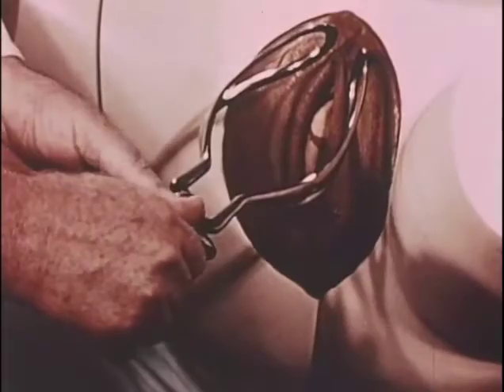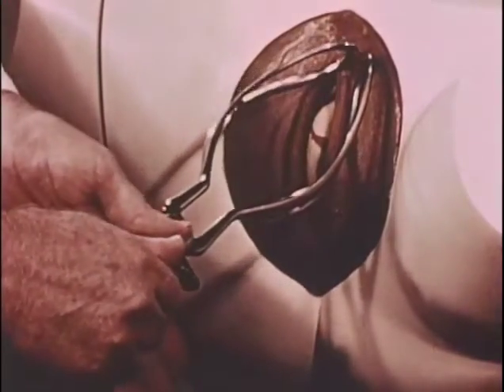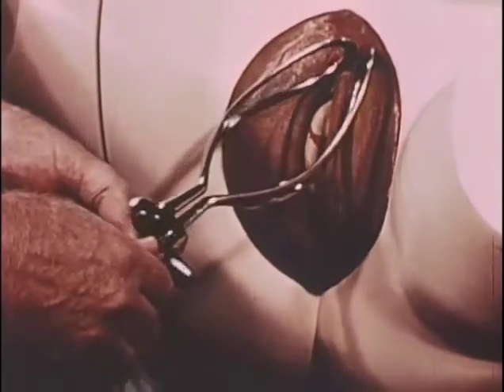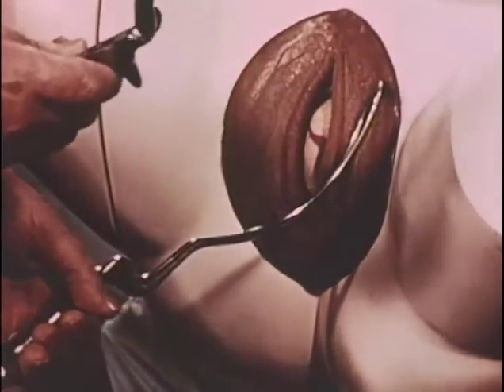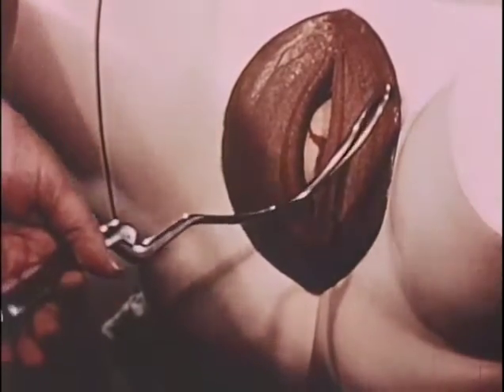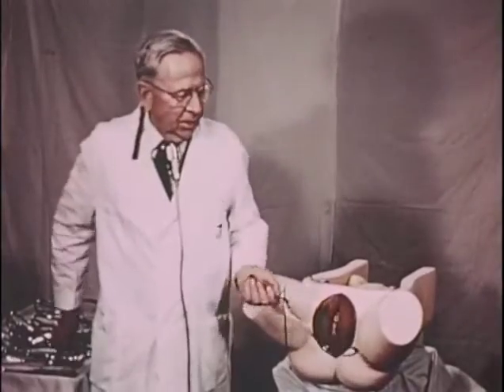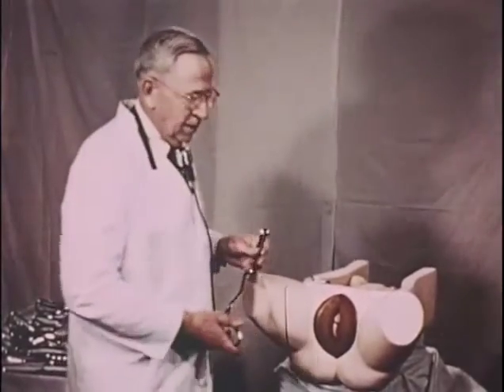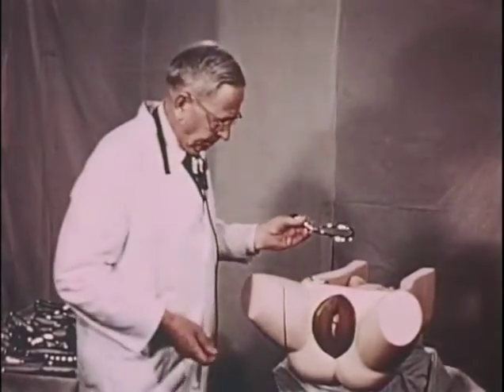Because our posterior blade is the one which is behind, our left hand automatically grasps the handle of the left blade, the right hand, the right blade, so that the right part of the instrument is discarded temporarily, and we proceed with the introduction of the left posterior blade.